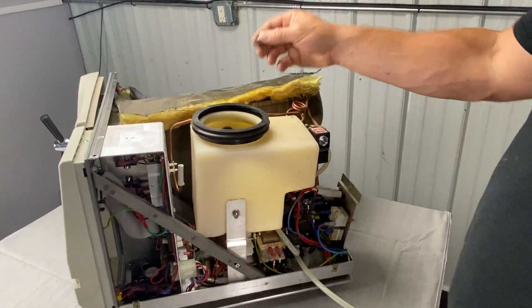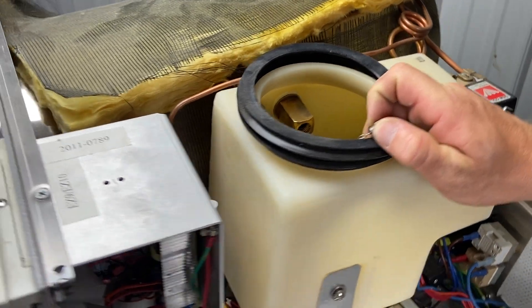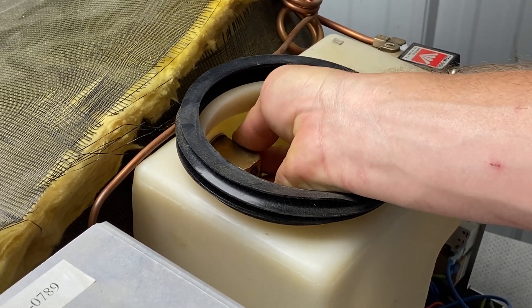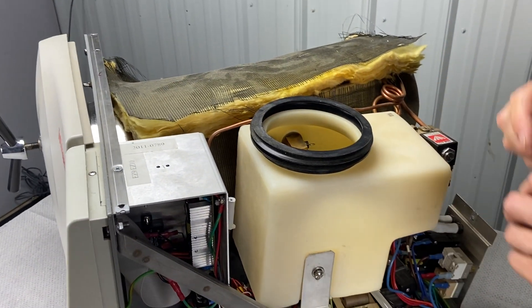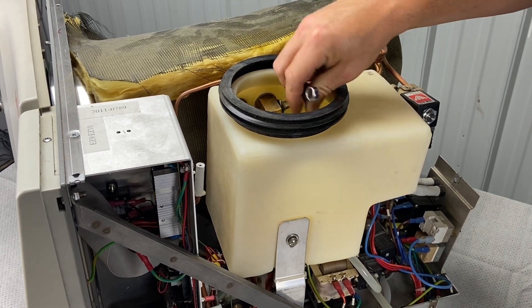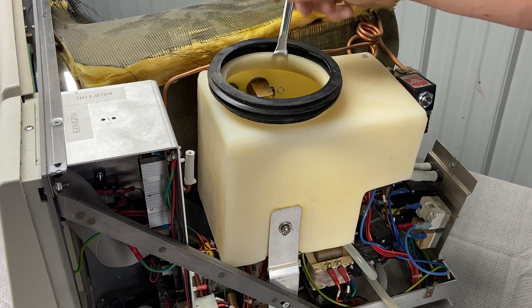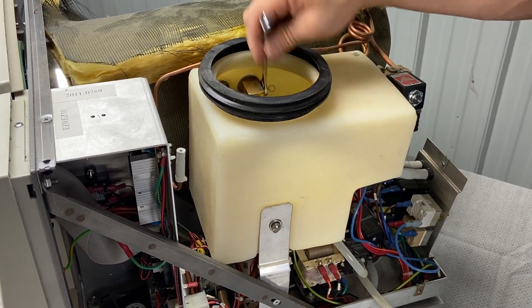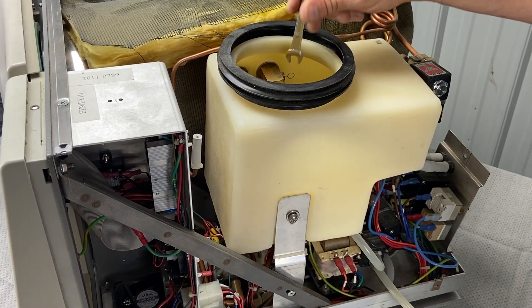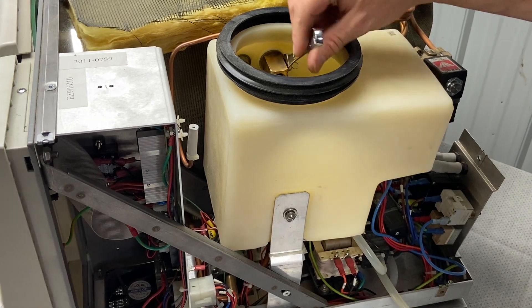Now we're ready to put the air jet and safety valve in. We took off the safety valve first, then the air jet — now we're going to put the air jet on first, then the safety valve, so I can get my hand in there. You don't want to cross-thread these, so get them hand tight. I've got mine in there hand tight. Sometimes you'll drop this into the water, which is why I recommend draining all the water out and possibly wearing gloves. I'm just tightening it now.